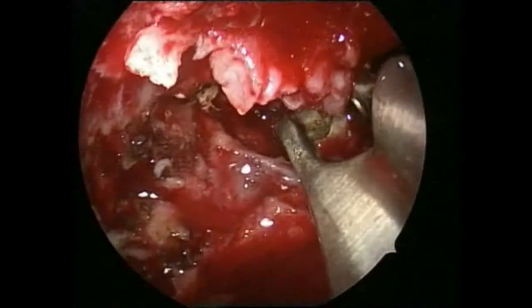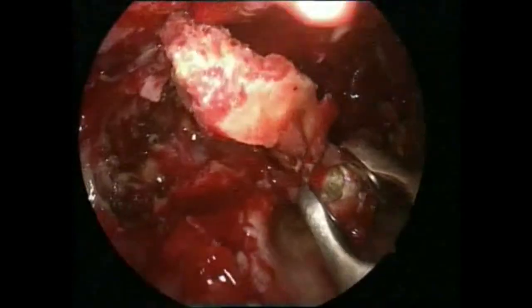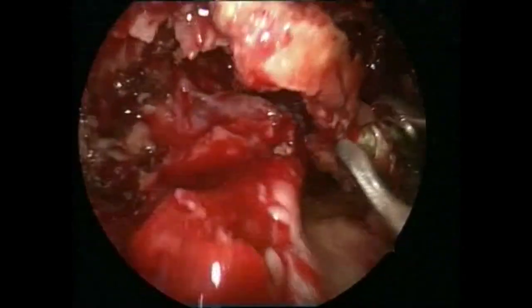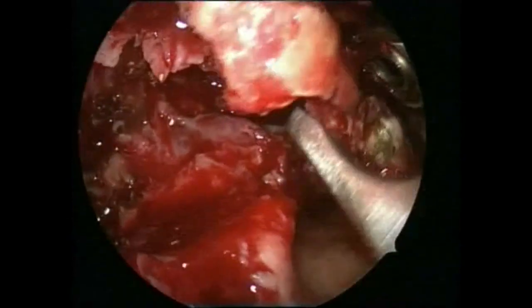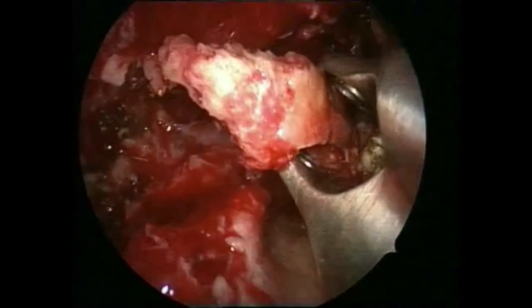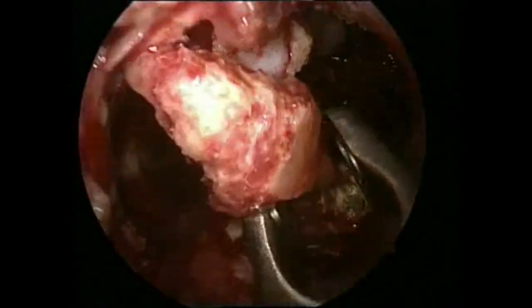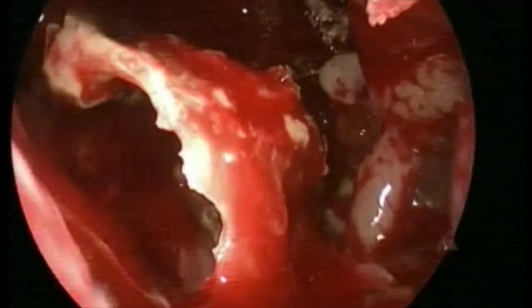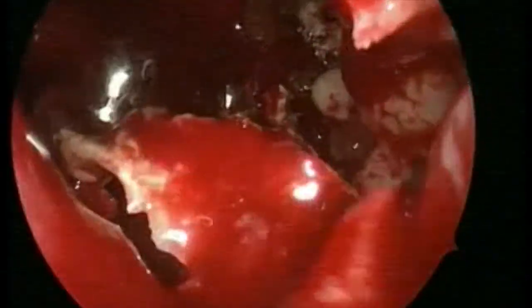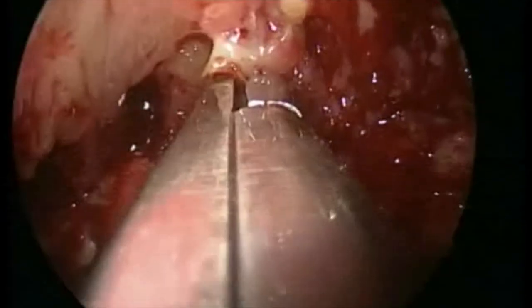This is the trick which I want to mention: you get hold of the necrotic bone and remove it. In fact, go to the entire pterygoid process with the greater wing of sphenoid on the right side. Just hold the necrotic bone, twist it, get it out — it just comes off like that.